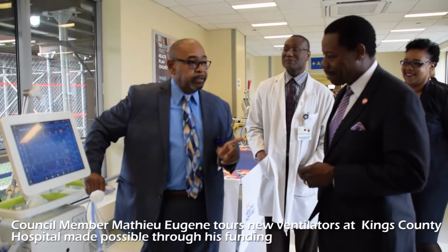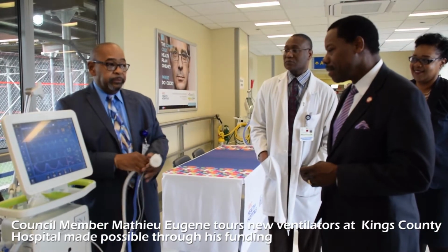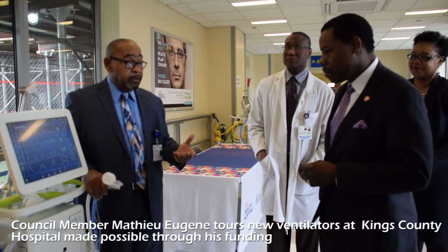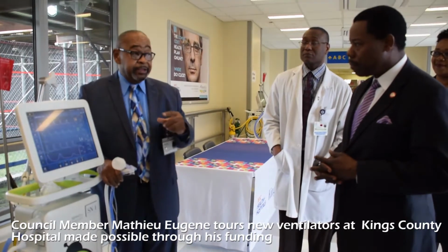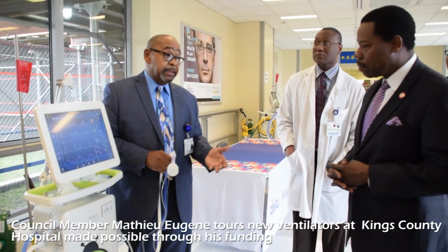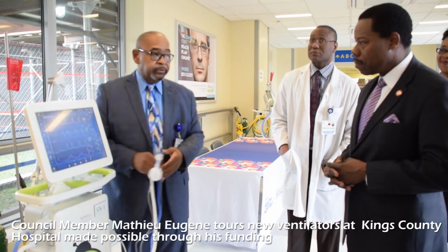The idea behind this is if one of the neonatologists only wants the baby to receive a certain volume, they can look at this and see, based on my settings, the baby's getting too much. So they can adjust the settings so that the volume the baby gets is less. It's consistent with their philosophy, their clinical ventilating philosophy. In fact, we put a baby on the machine last week and used that to fine-tune the settings.